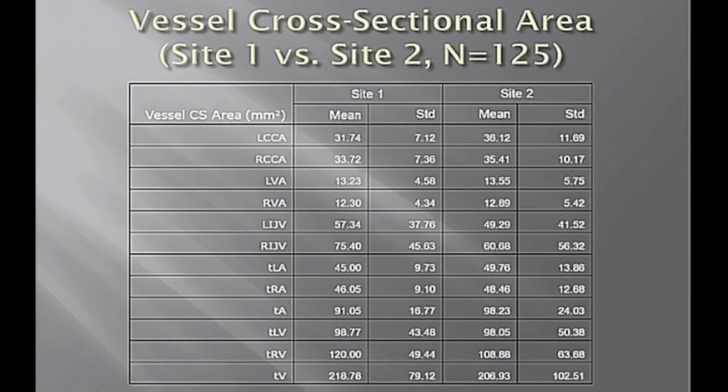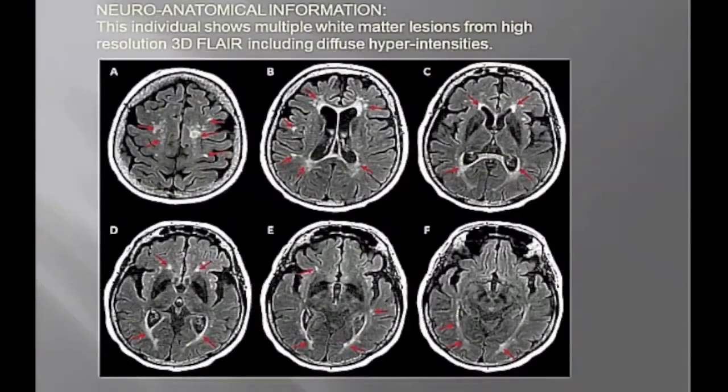So now we have lots of data here. We have the histograms associated with all this data. We have some good information. So the question is how else can we compare this flow data with what we have? Now we've done over 1,000 cases so far, but we haven't processed any FLAIR data until recently. We've just started doing that. We've only done about 25 or 30 cases right now.